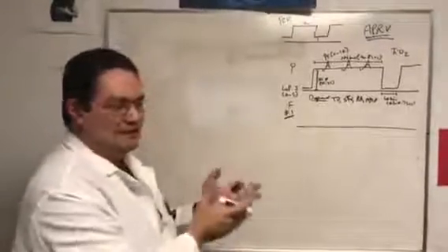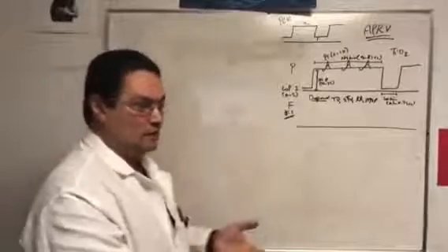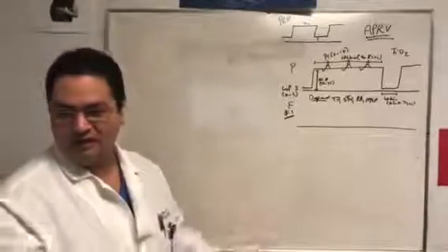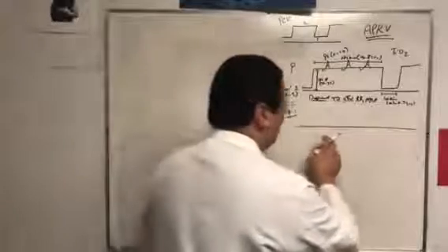So if you're in the Northeast, especially, and you say true APRV, classic APRV, and you put the patient on, and the patient has a pneumothorax, nobody's gonna listen to you anymore. You'll be a stamped idiot, like forever, right? So please pay attention to this one.